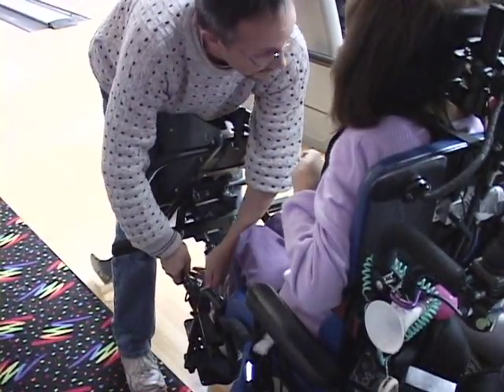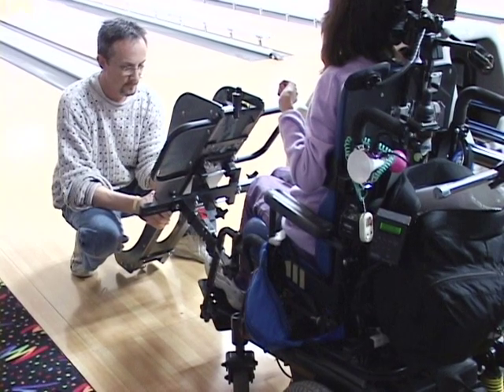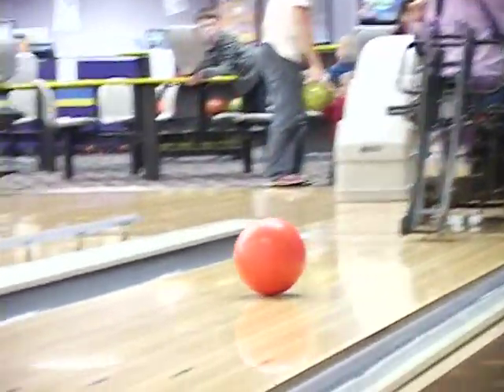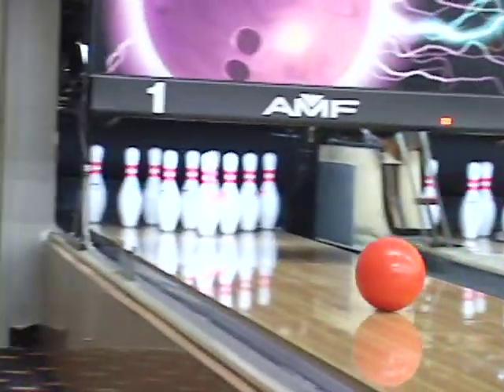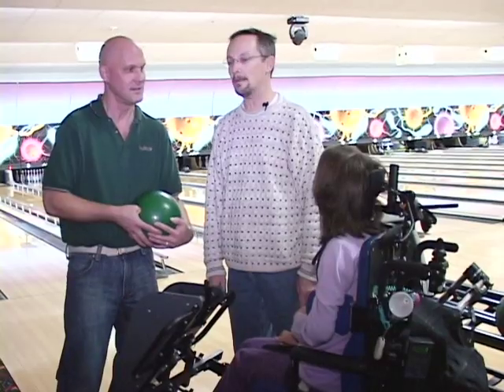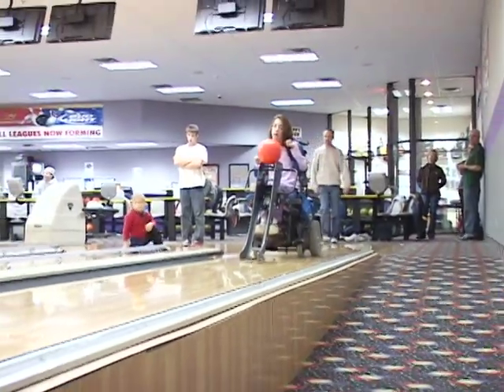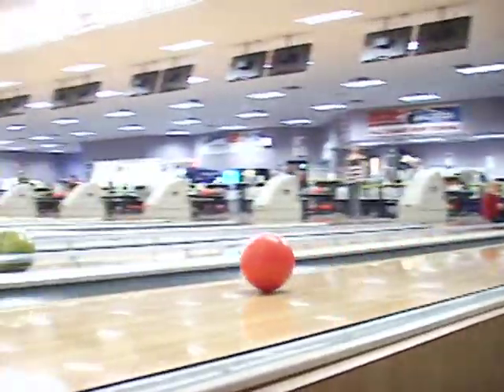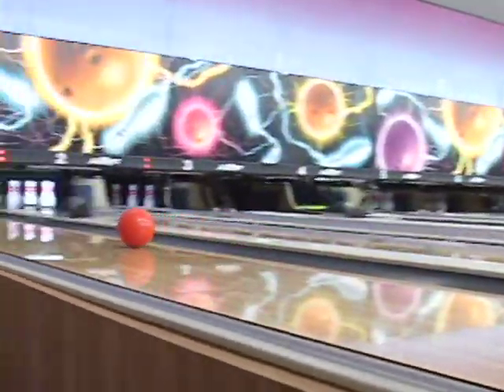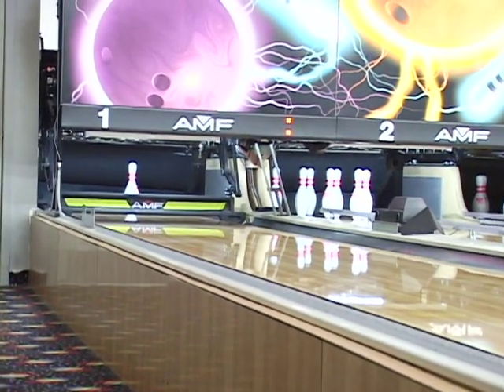They've got a couple of levels here set so that you can make sure that it's level, and you're ready to go in about 30 seconds. And I understand that your bowling team helped you buy this little bowling piece. We did the research over the winter on the internet and found the I-CAN bowling arm and asked the bowling coach if the team could help us out, and she did some research, checked out with her supervisor, and found out that they would purchase it, and they're letting us use it during the off season.